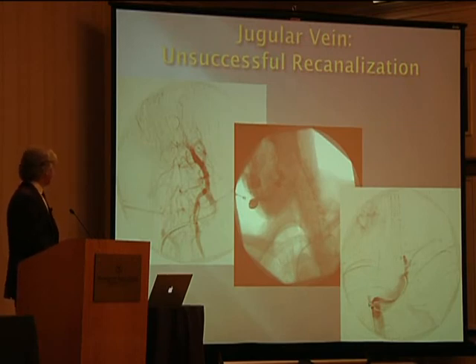Again, sometimes we just can't get through these stents. One of the problems is that the stent's been occluded for a long time. The thrombus tends to be kind of rubbery, so it's hard to get into the stent, hard to get across the stent with a wire. In this case, multiple contrast injections opacify these thyroidal branches and vertebral branches, with no opacification of the jugular vein.